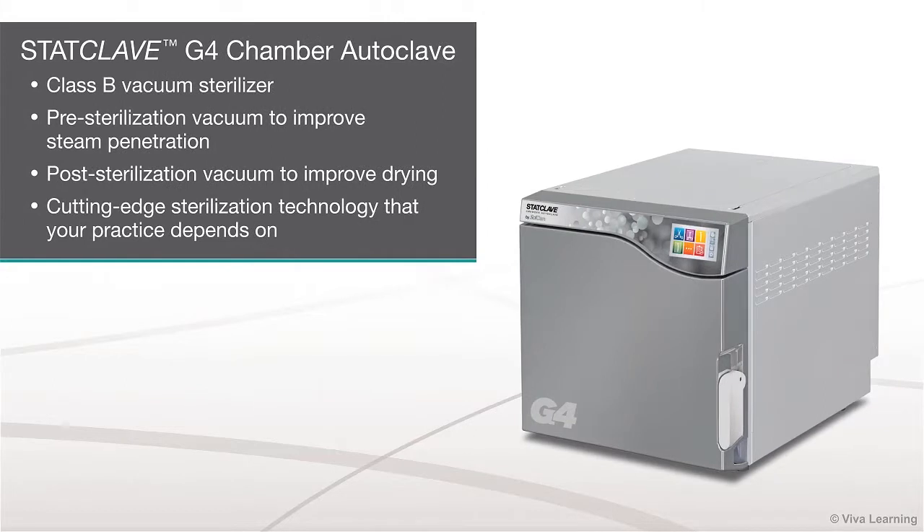Now, SICAN is excited to bring you the StatClave G4 Chamber Autoclave. StatClave G4 is a Class B vacuum sterilizer that incorporates both pre-sterilization vacuum to improve steam penetration and post-sterilization vacuum to improve drying. In short, it's the type of cutting-edge sterilization technology that your practice depends on.